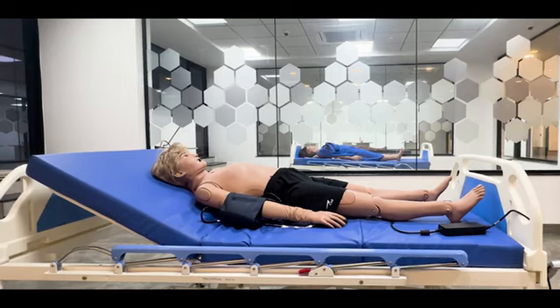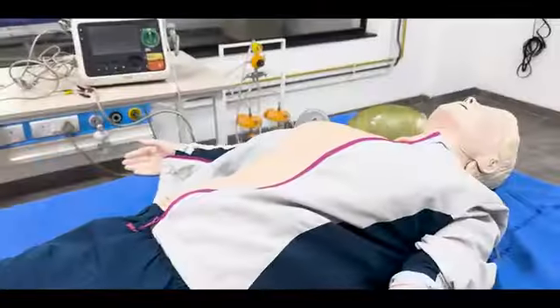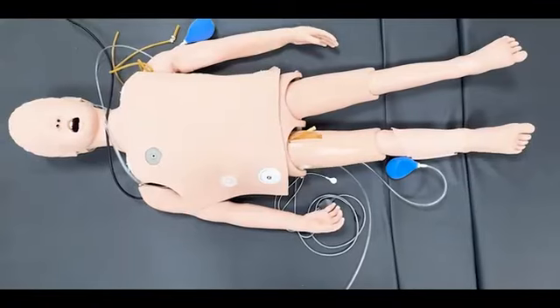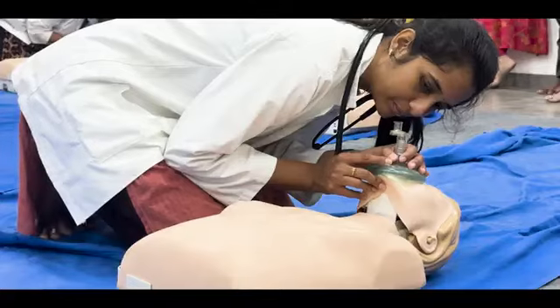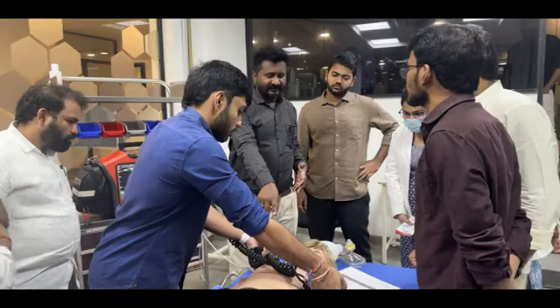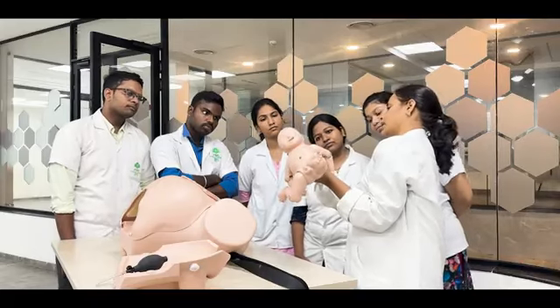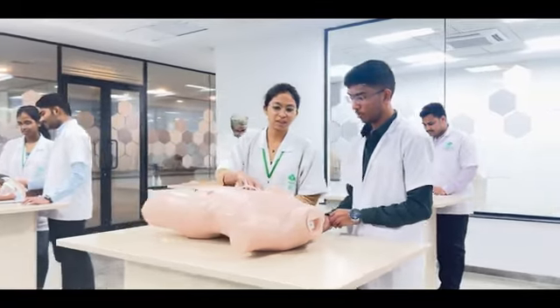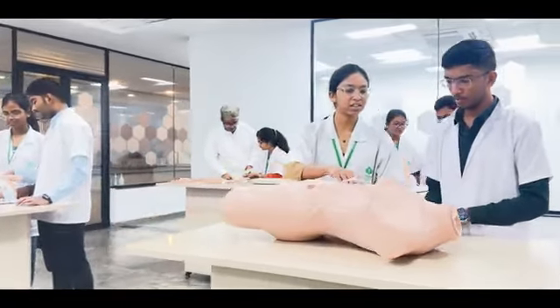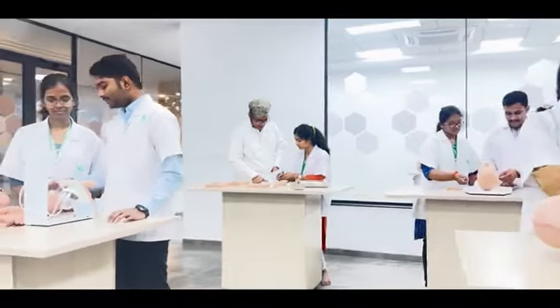So ours is a state-of-the-art skill lab where you have got the different stations, different manikins, where different clinical scenarios are practiced. For example, the basic life support system, the advanced cardiac life support system, simulations for a normal delivery, the simulations for a trauma patient, the simulations for post-operatively critical patients, the simulations in an ICU.